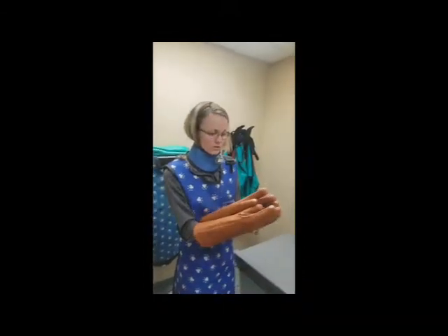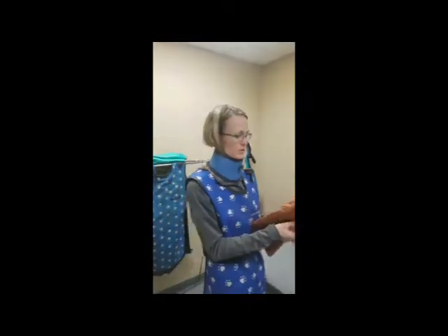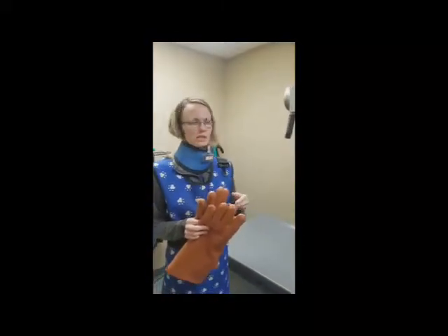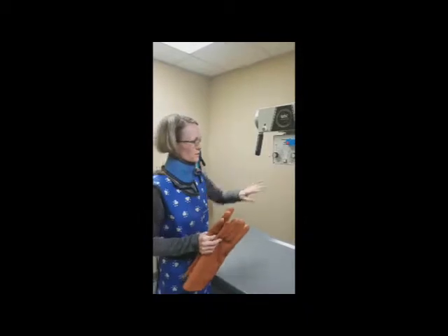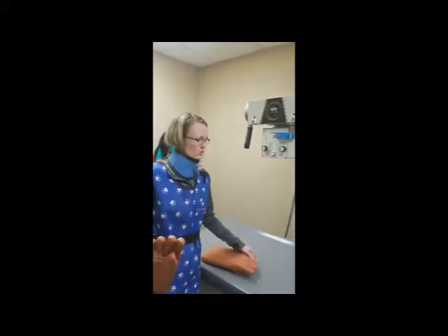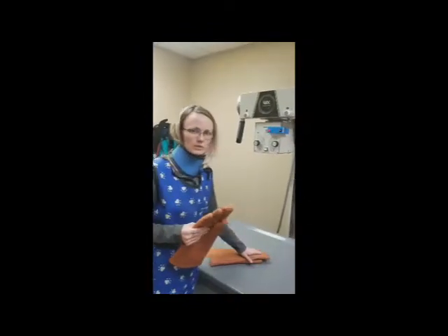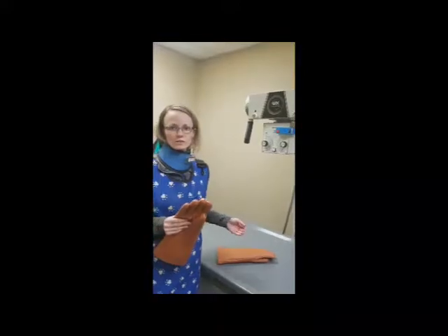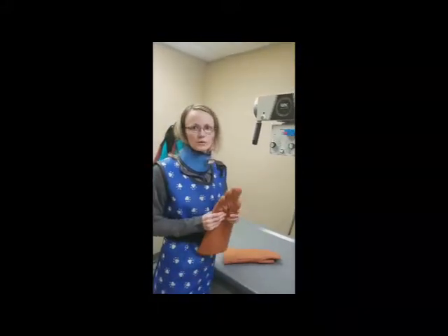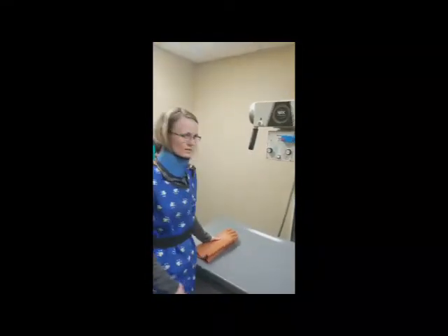The gloves are important because you're not only protecting your hands, but you want the fingers closed so nothing is getting to them. The big part is that when the x-ray beam is shining down, you don't want any of your hand in the primary beam, because the gloves only protect less than 25% of the beam — so you're still getting 75% of that radiation in your hand. That's definitely not what you want.